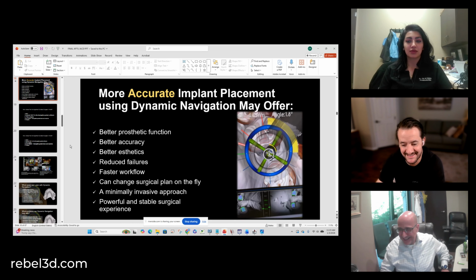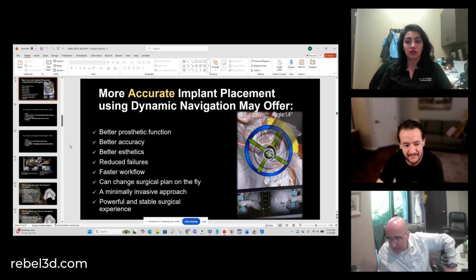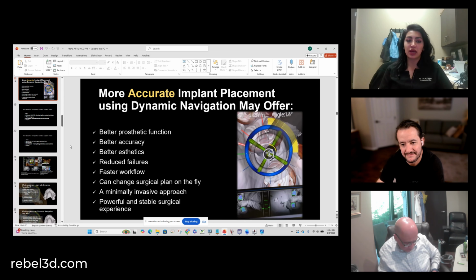One double arch case a day is pretty good practice, for sure. With a few singles afterwards or something, fine. Or single arch. And not just that, we also tend to deliver the next day anyway. So we want to make sure that the technicians, the designers have enough time to receive all the scans and start working on them and finishing things for the next day.